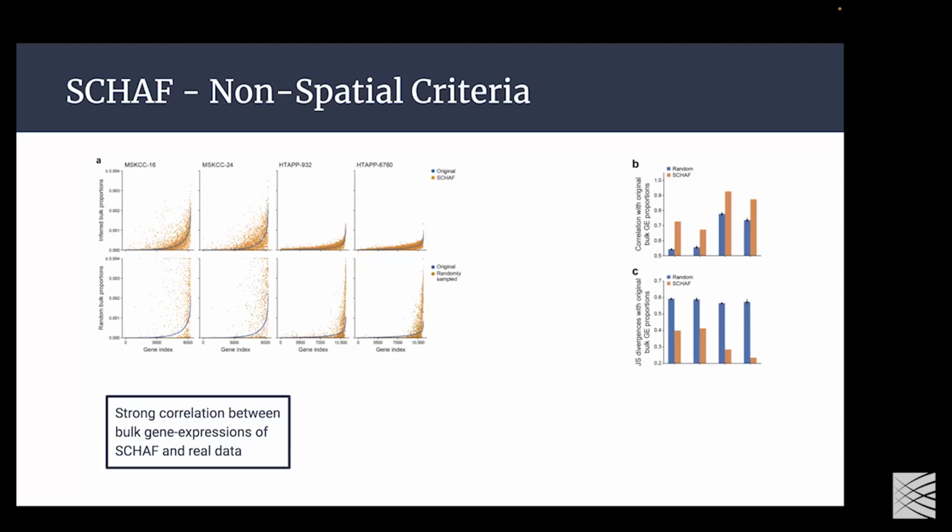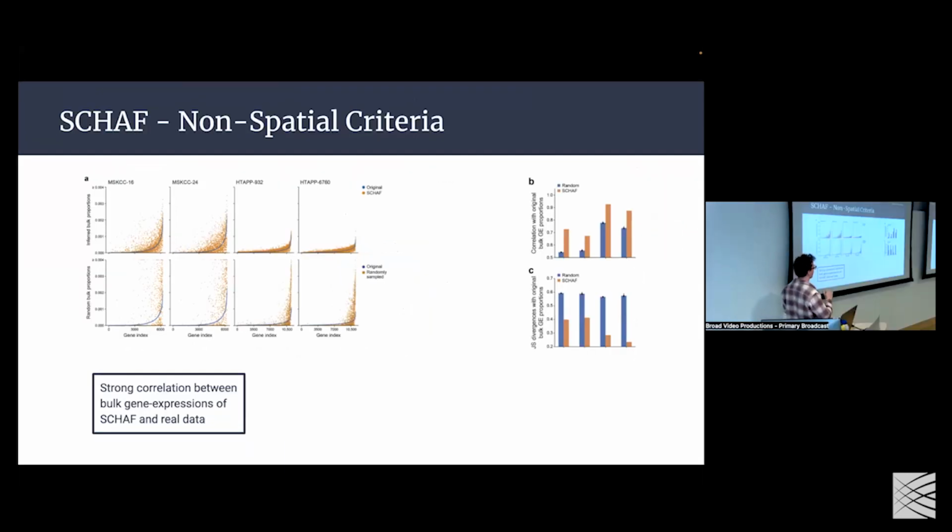And the first thing that we show here is just a very blunt sanity check type of result. If we look at a histology stain that is put into our model for testing, we generate a single cell data set from it. We compare that single cell data set to the goal, what we're trying to generate. And we look, okay, how can we compare the bulk gene expression of these two? This is more or less, you just take all the cells, you add them up, you find the mean expression value, and then just see how strong the correlation is.